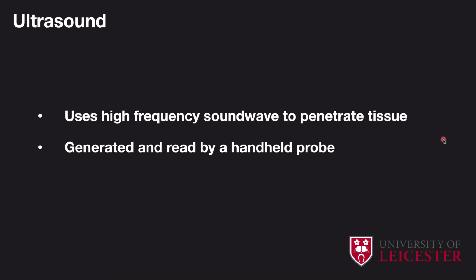Let's begin with ultrasound. As the name implies, this uses high-frequency sound to penetrate the body. A handheld probe is placed on the patient's body. Sound waves are generated and received by the probe, and then transferred to a computer to be displayed as an image in real time. Think of the probe as a fancy microphone listening to sound, and the computer then works out what it means and displays the information as an image, in real time.